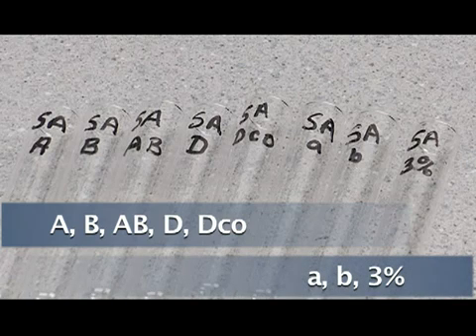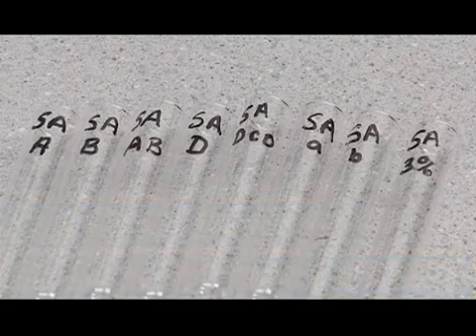And we're going to label a tube for the 3% suspension. The 3% suspension can be anywhere between a 2 or 4% suspension, but for ease of labeling we call it a 3%. For this particular procedure, a 2% suspension works best. Some of the other procedures need closer to a 4% suspension.